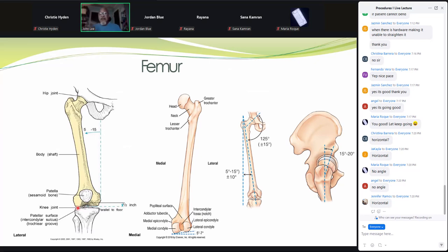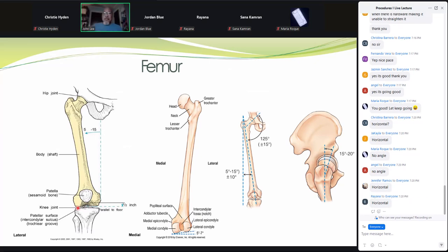Now, on the forum that I was looking at, there were a lot of people who said always angle on the lateral. There is a method of doing the weight-bearing knee without having to do the angle, but it has to do with setup. And it really does have to do with setup.